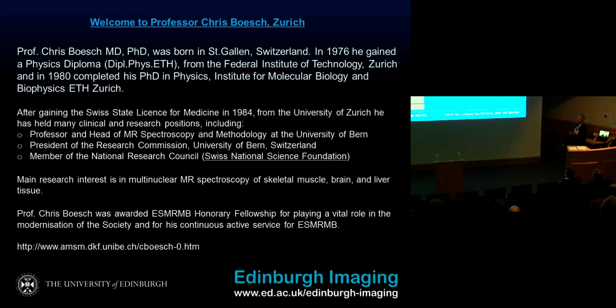Some are suggesting absolute concentration measurements and so on, but it's quite difficult. On the other hand, there has been a meta study where they were looking at the standardized ROC curve and got quite some nice results of sensitivity and specificity for this kind of study. So this total choline still has some technical problems, but is often used and obviously quite helpful.